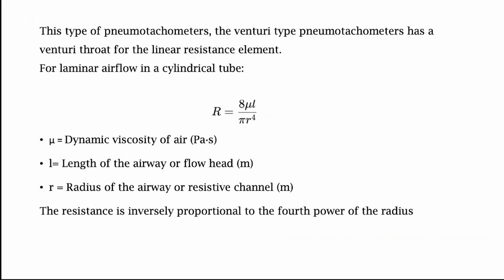Also, whether the flow will be laminar in the tube or not is determined by the Reynolds number of the flow, and that's a topic in fluid mechanics beyond the scope of this course. Essentially, I can determine whether the flow is turbulent or laminar depending on this number. And the flow rate can be quite huge.